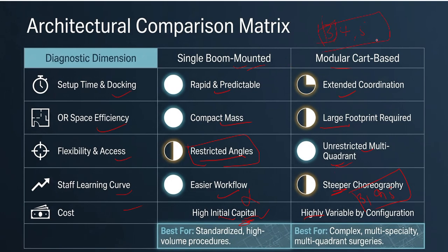Because most of the time you will do general surgery, in that case your cost of surgery will also reduce, and the initial investment will also reduce. So that is one perspective. Generally all the robotic surgical systems come with a 4-arm configuration, and sometimes they will use a 5-arm configuration also.